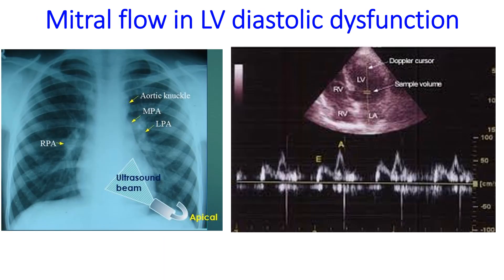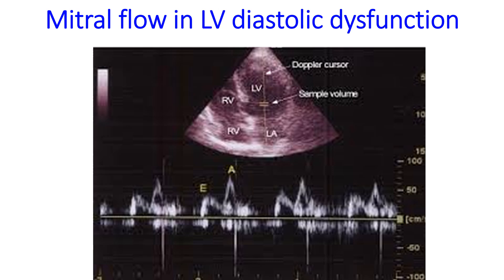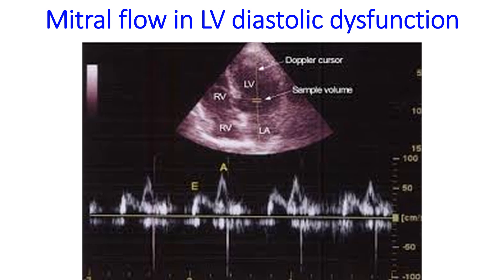Doppler interrogation of the mitral valve is usually done from the apical four-chamber view. The transducer is placed directly over the apex beat and the echo beam is directed upwards. A good four-chamber view of the heart is obtained showing all four chambers and both atrioventricular valves. The Doppler cursor is aligned along the long axis of the left ventricle passing through the mitral valve, and the sample volume is placed just distal to the mitral valve to pick up flow in the left ventricular inflow. The initial portion of diastolic flow is called the E wave (early diastolic) and the final portion during atrial systole is called the A wave.